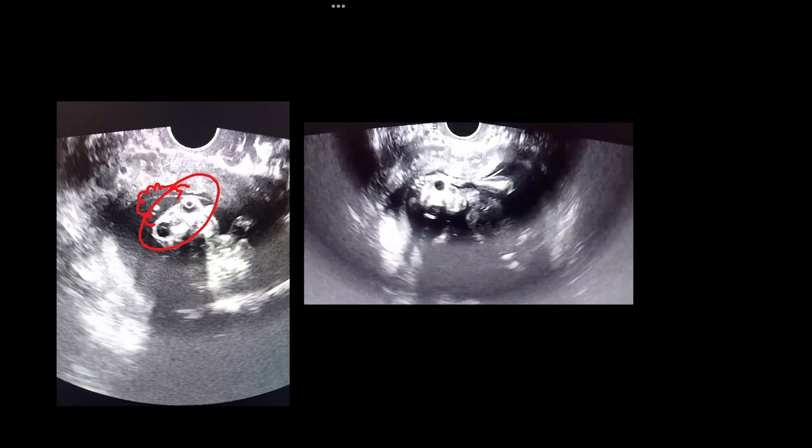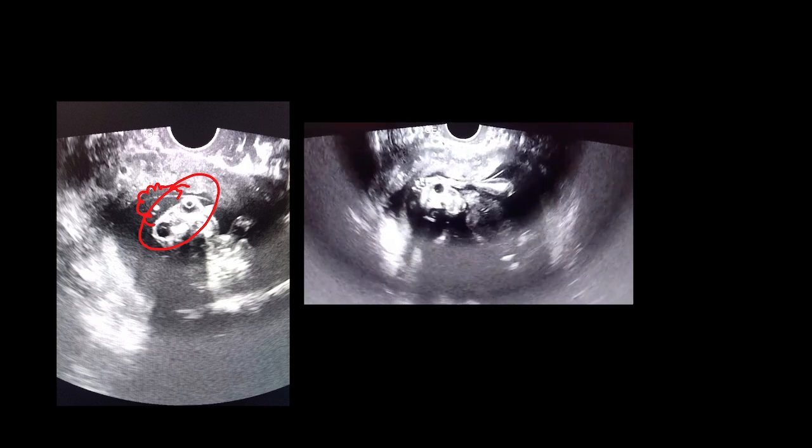And here I have shown one video. See, the fetus is moving. There may be swallowing because the brain stem is intact, but the cerebral hemisphere has all degenerated. So there is nothing here, and this is the cranium and this is the face. So facial structures are intact. The eyeball is there, the nose is there, the mandible is there.